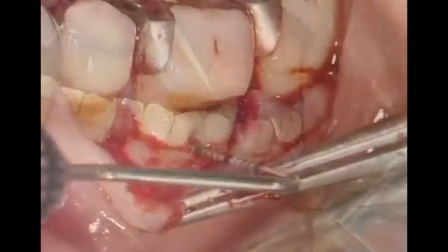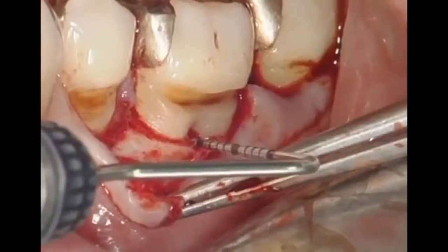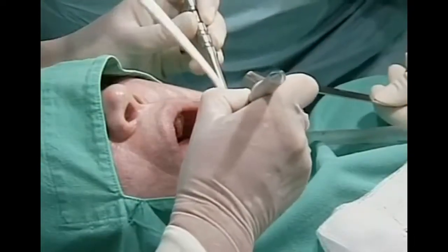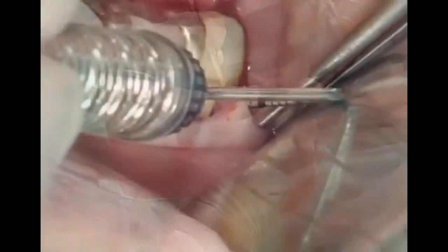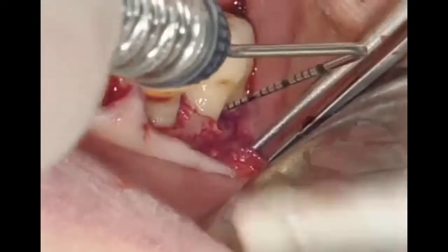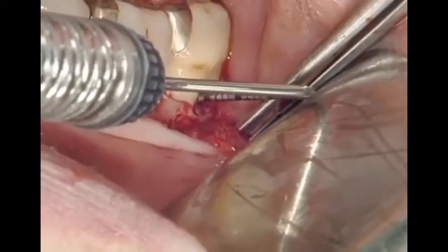As the radiographs revealed earlier, a degree 2 furcation defect is visible on tooth 3.6. In addition, tooth 3.7 will be treated because it too has been classified as a degree 2 furcation defect.